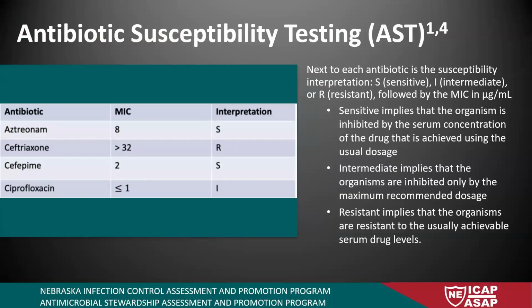And these are most often associated with your Enterobacterales. So you're going to see them with E. coli or Klebsiella, Citrobacter, Morganella, there's several of them. Or Pseudomonas or Acinetobacter can also have a carbapenemase gene.